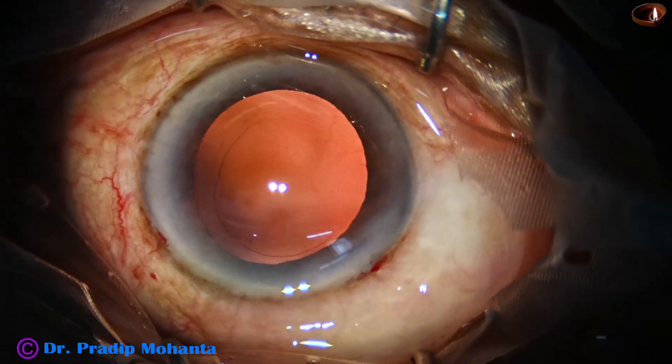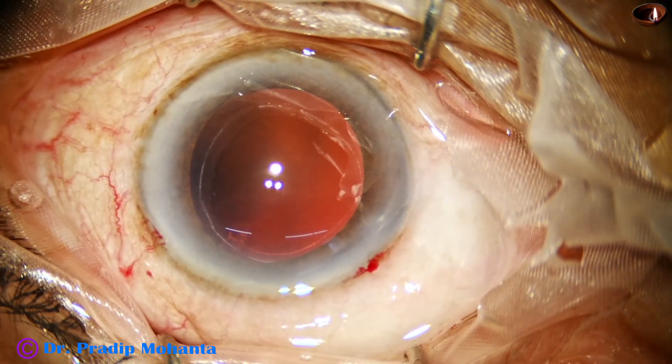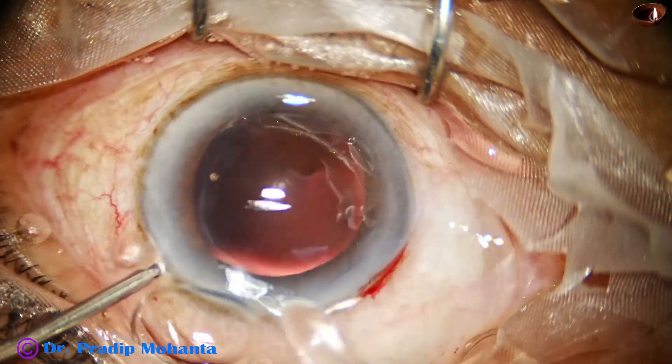The cortex has been cleaned by the handpiece itself. This is a tricky business — don't try this unless you have done about 2,000 surgeries.